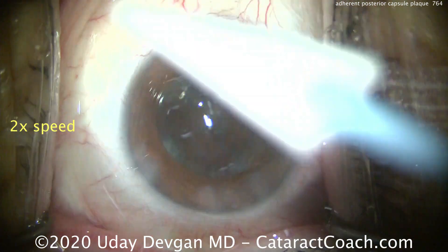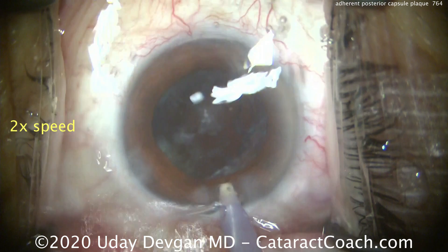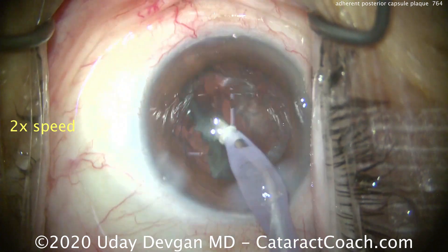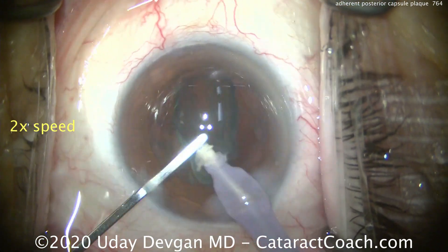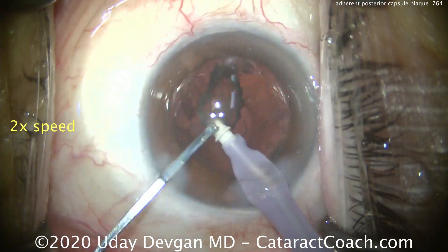After those are removed, we'll get that epinuclear shell out as well and finish up this case. Now when I take the IA probe and start to remove this lens cortex, look at the posterior capsule. We get that epinuclear shell out — that comes down relatively easy. We can use our second instrument here, a spatula, to help push that down the port of the IA.